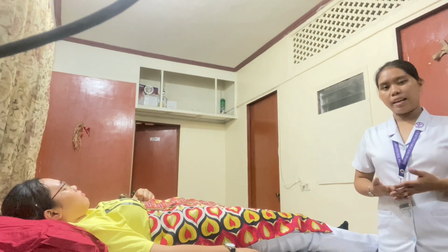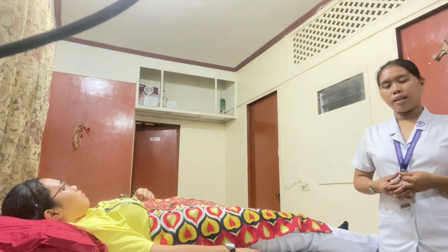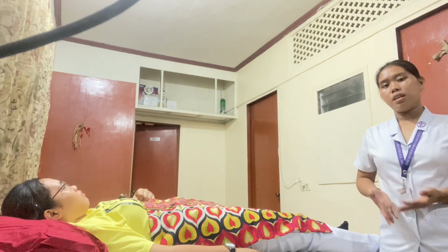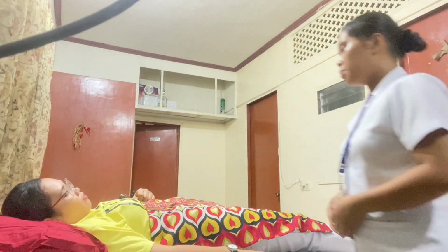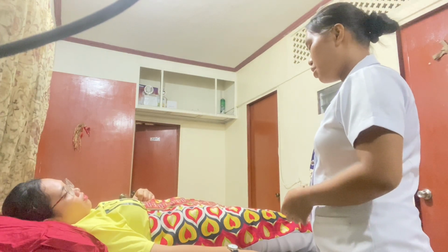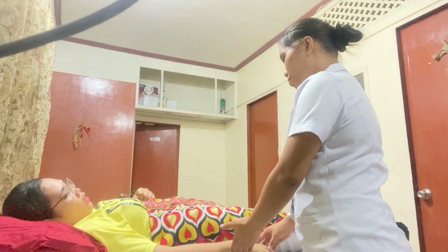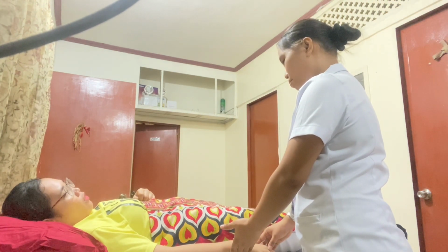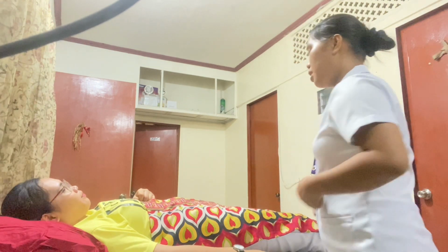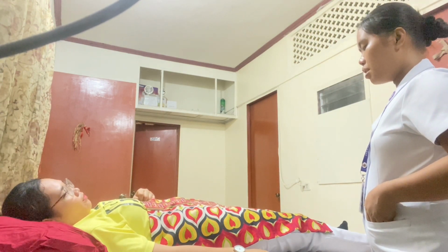So now prepare the client, introduce yourself to the client and verify the client. This is for the verification that you have the right client, that you will give the right medication to her. Good morning, ma'am. My name is Grace Danyan, your student nurse today. May I see your wristband, ma'am? Please state your complete name, ma'am, and also your birthday. Okay, thank you. So now, ma'am, I'm going to demonstrate the subcutaneous injection.